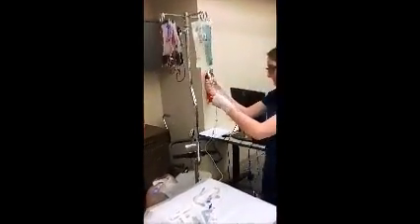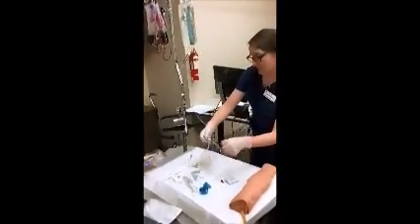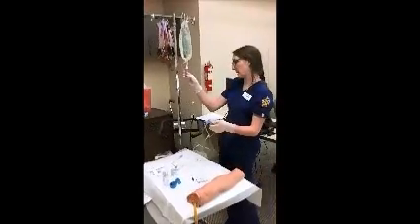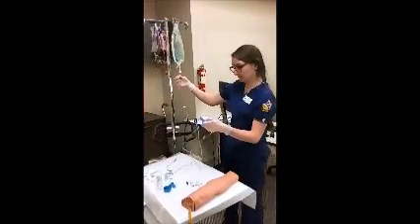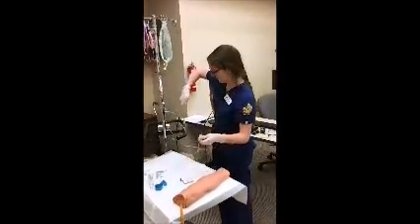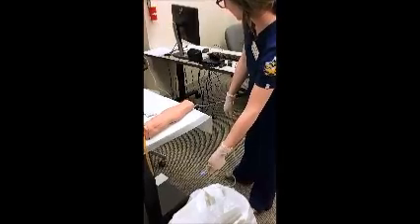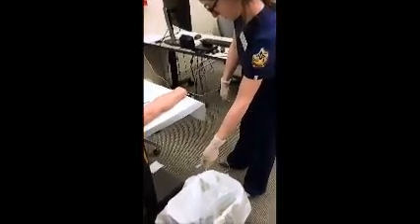We're going to prime our tubing. So to do this, we're going to need to unclamp, and we're going to need to unclamp the roller as well. And squeeze and get some fluid to fill our drip chamber. There's a little line in here. If there's no line, you usually want to go for just about halfway. And then we will very slowly prime the tubing here. What we're doing is just preventing any air from going into the patient's bloodstream and causing an air embolism, which would not be good.